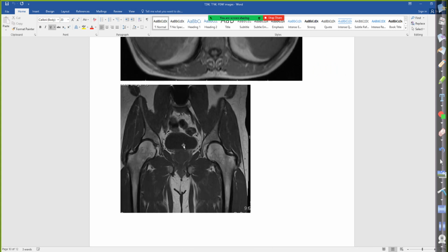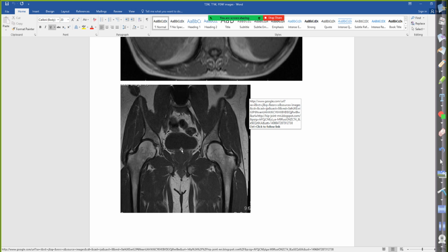Here we have a soft tissue of a male pelvis, so we've got the prostate, but here is that bladder, and it's filled with urine, and it's dark, so it's a T1. And if you didn't know that, or couldn't see the bladder, you could go off the muscle, and it's not as dark as in a T2.